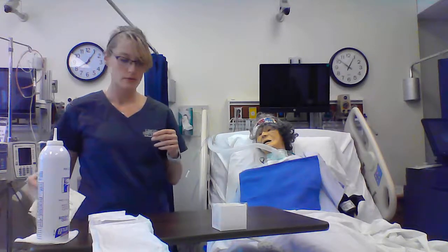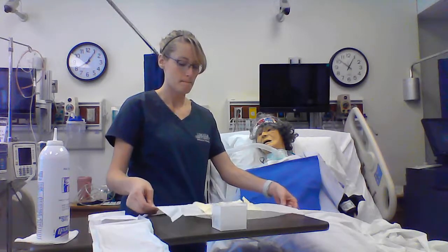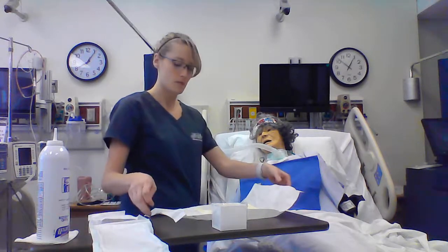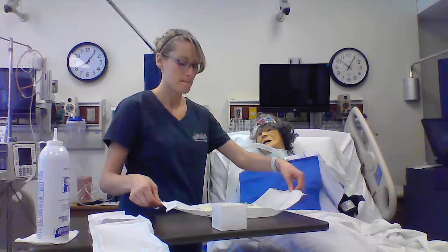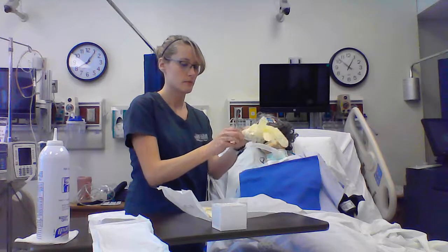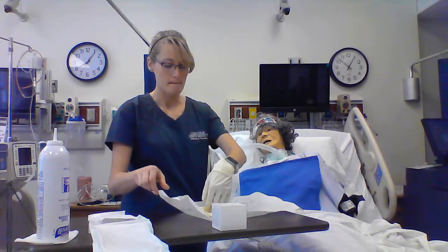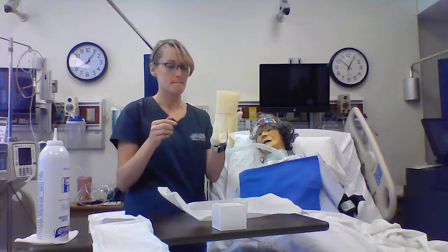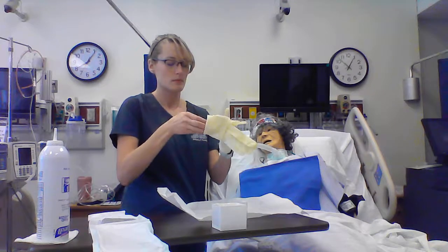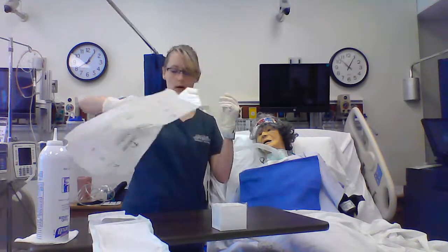And then I'm going to don sterile gloves. So I'm going to do my non-dominant hand first. I did not touch the inner cuff there. I know it may look like I did, but my finger did not make contact. And don my dominant hand. And then I can throw this away, making sure to pinch the inside of my packaging. So I would throw that away.